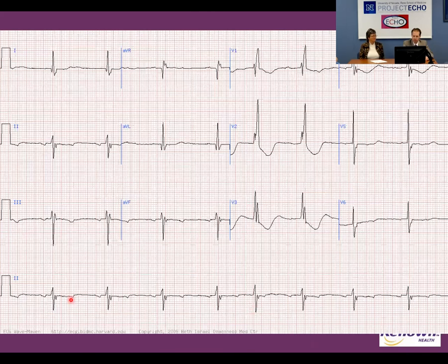If you look a little more closely at the EKG, you notice that this T wave seems to have a different duration, a different QT interval than this apparent T wave. That seems a little bit odd. And if you look at the P wave in standard 2, it's downgoing. A sinus P wave should be upright in 2, 3, and AVF, the inferior leads. So there's a P wave axis as well.